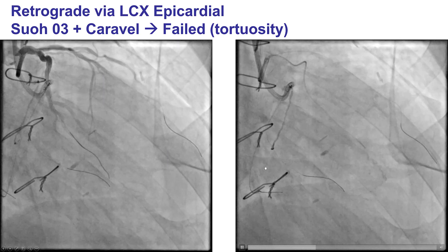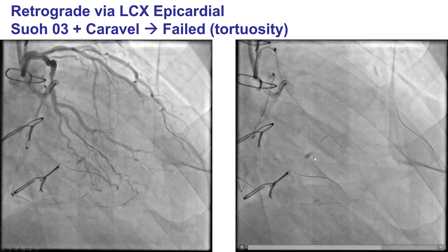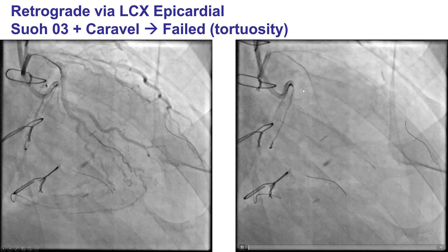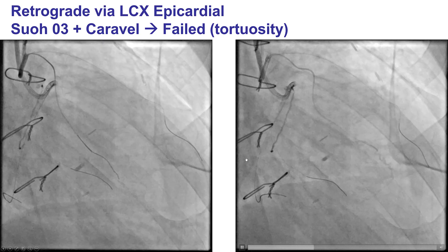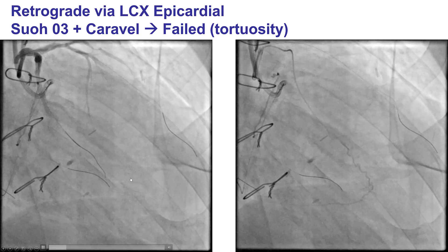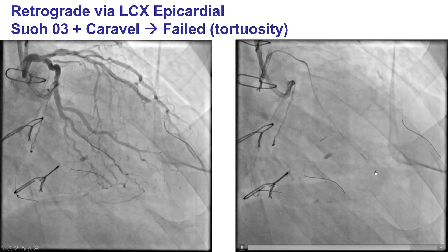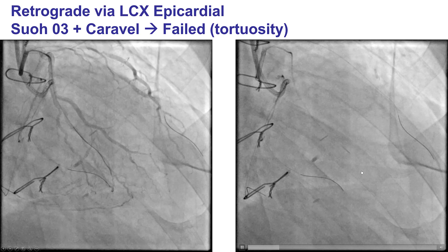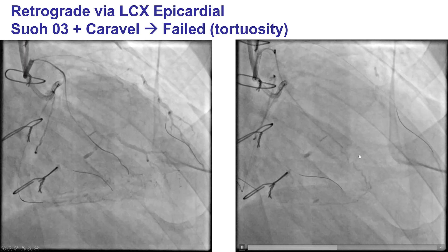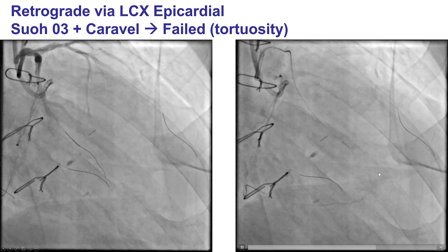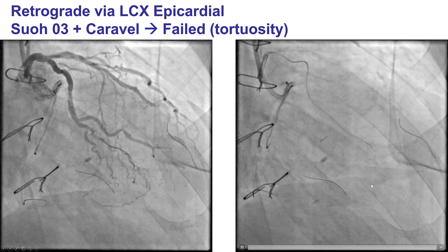We decided to attempt crossing through an epicardial collateral coming from the circumflex. That collateral was fairly tortuous, as can be seen on selective injection. We tried to cross it using a Suoh 03 guide wire, but we were unable to get through.